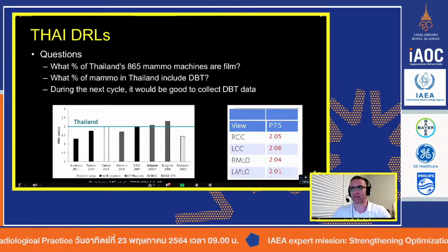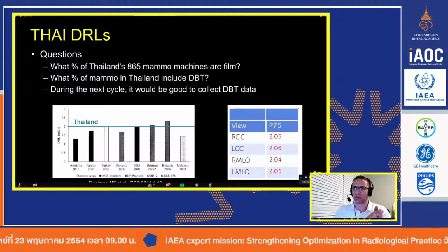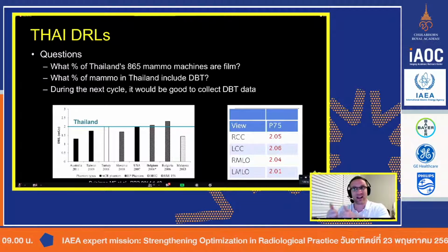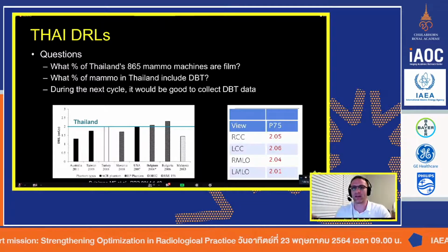And then, as Hong is mentioning, they have a way to say, oh, this is a 3 centimeter breast and it's lower, so we're good because it's smaller. This is a bigger breast and it's higher, but it's okay. On average, percentage wise, it's okay.